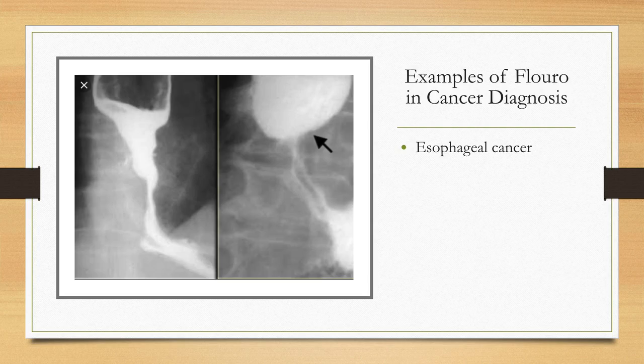So that's actually what it looks like when there is an esophageal cancer present. It causes this narrowing. The white is what you drink, and it can't get through that narrowing very well. So that would be very concerning for esophageal cancer. We saw that on an esophagram for someone coming in with difficulty swallowing. Sometimes they can be a lot more subtle and be short little areas of narrowing, but that's what we're looking for.